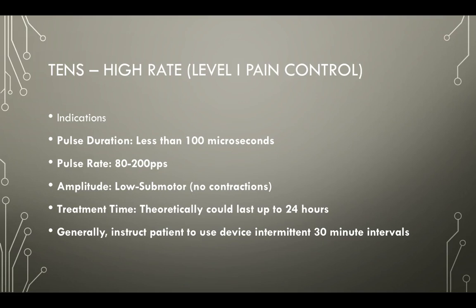Someone can potentially wear this up to 24 hours. Again, they're going to accommodate, so is that really the most effective? But if we're trying to not use medications or things like that, this could be used. You can use any of your electrode setups, like I said: the monopolar, the bipolar, the bifurcated, or potentially quadpolar. It depends on what you want to target, how deep you want to go. So you need to make that decision based on the target tissue that you're setting up.